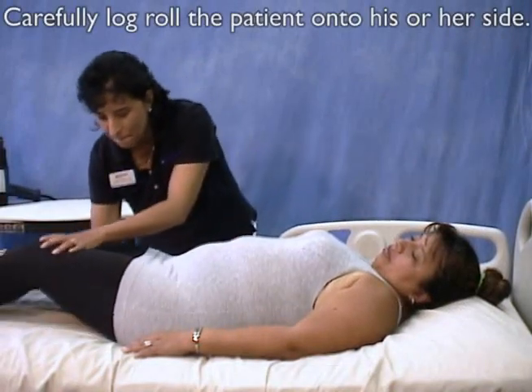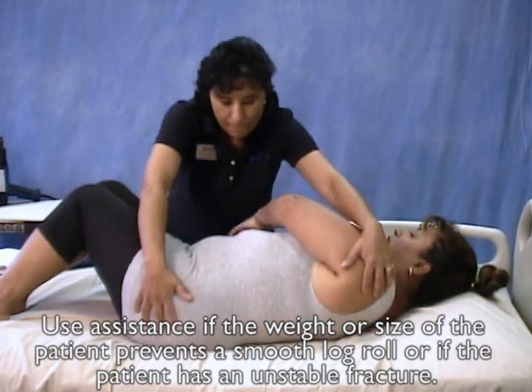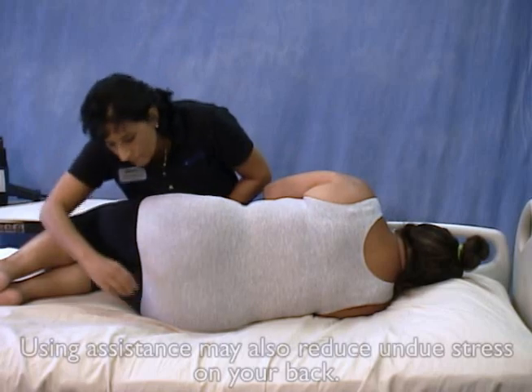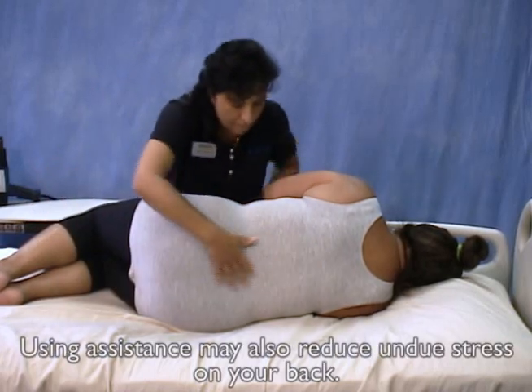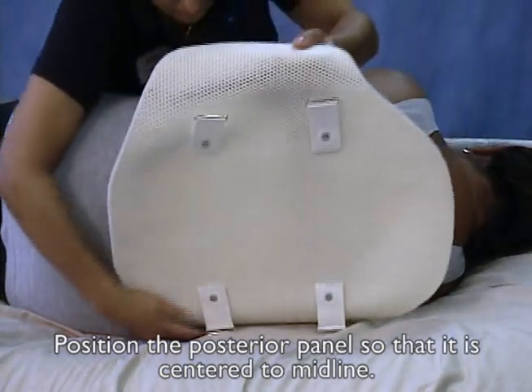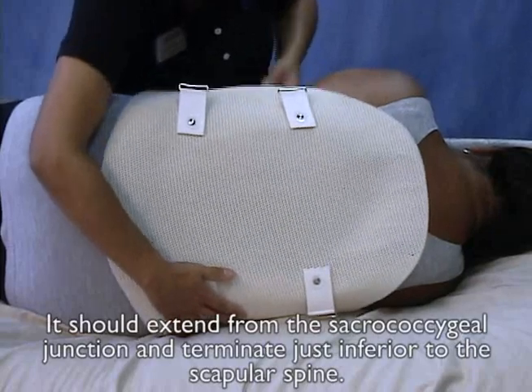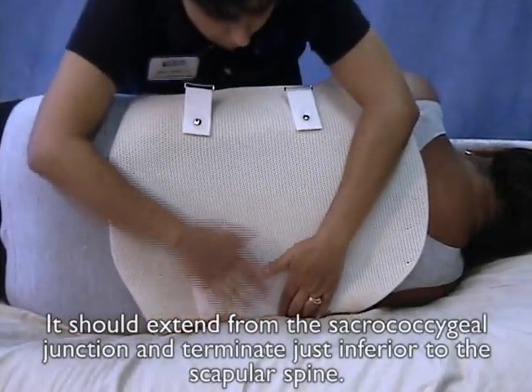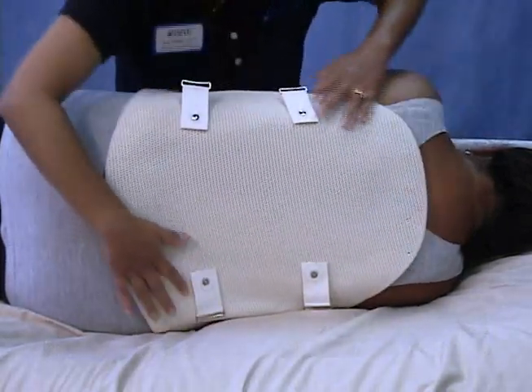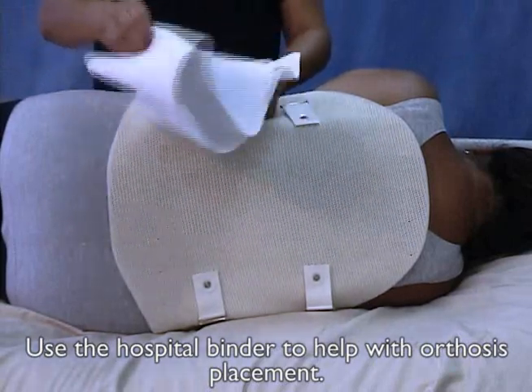Carefully log roll the patient onto his or her side. Use assistance if the weight or size of the patient prevents a smooth log roll, or if the patient has an unstable fracture. Using assistance may also reduce undue stress on your back. Position the posterior panel so that it is centered to midline. It should extend from the sacrocoxygeal junction and terminate just inferior to the scapular spine.